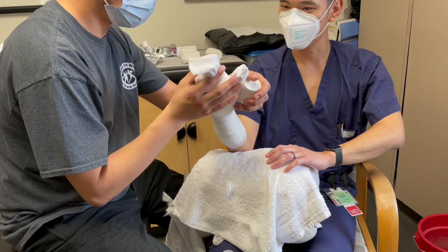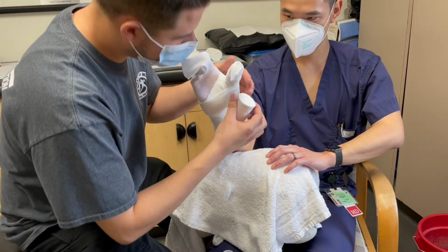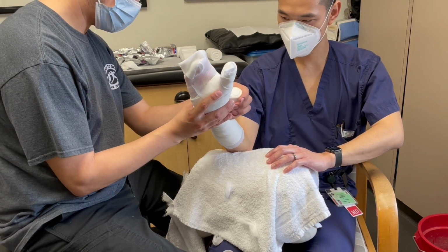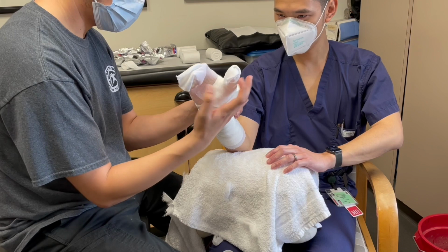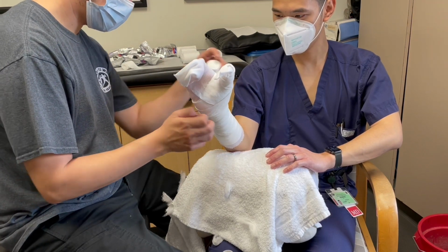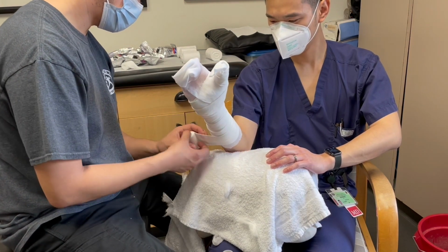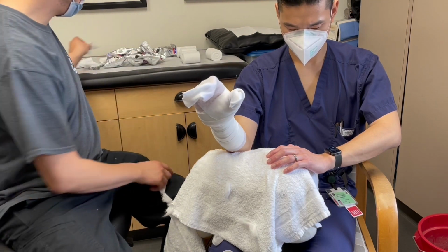Remember to keep the patient in the desired position. That is the padding for a thumb spica cast.